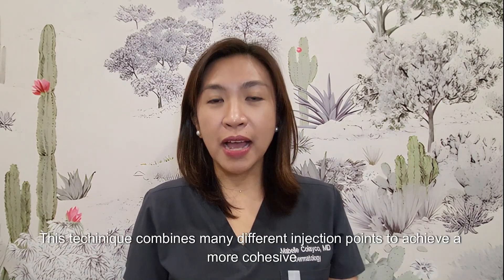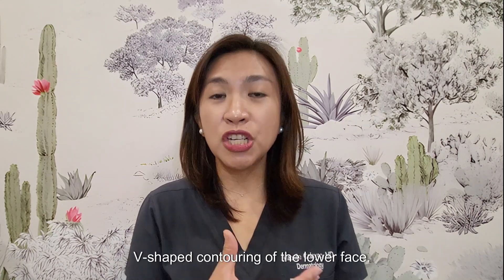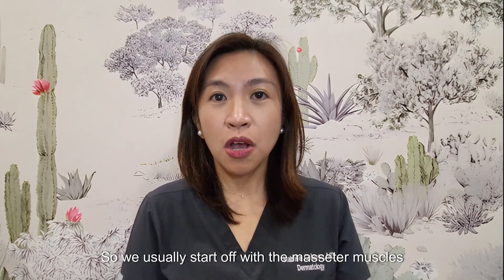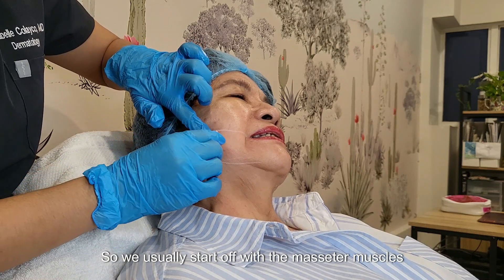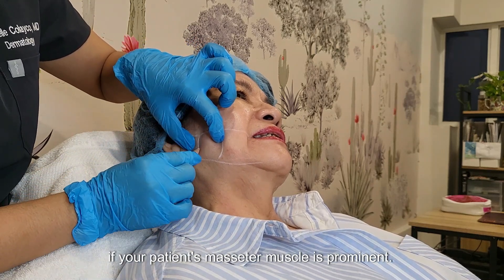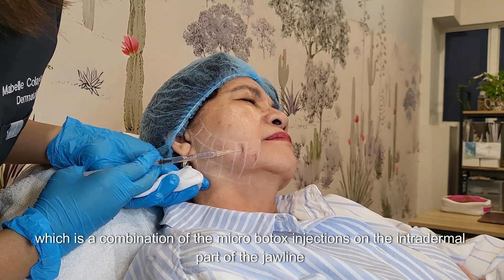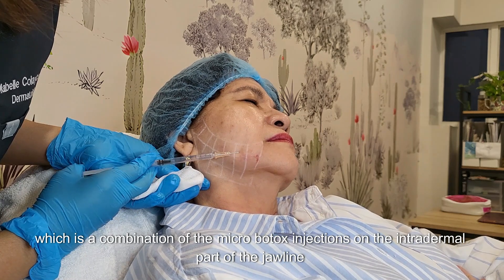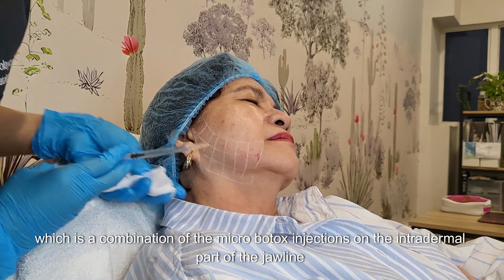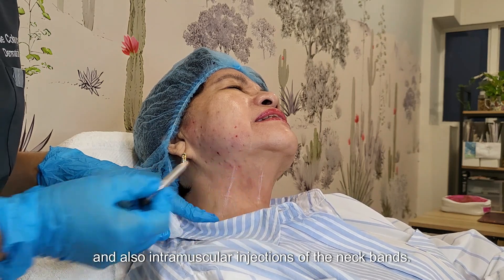This technique combines many different injection points to achieve a more cohesive V-shaped contouring of the lower face. We usually start off with the masseter muscles here if your patient's masseter muscle is prominent, and then we do a Nefertiti lift, which is a combination of micro-Botox injections on the intradermal part of the jawline and also an intramuscular injection of the neck bands here.